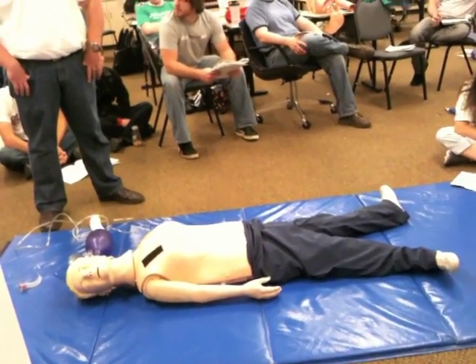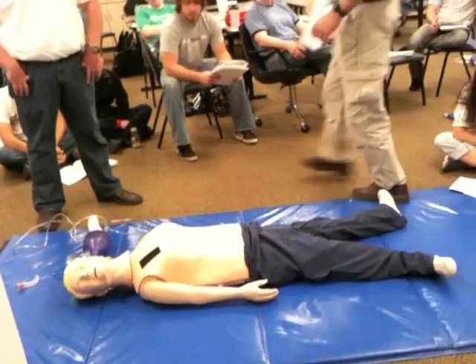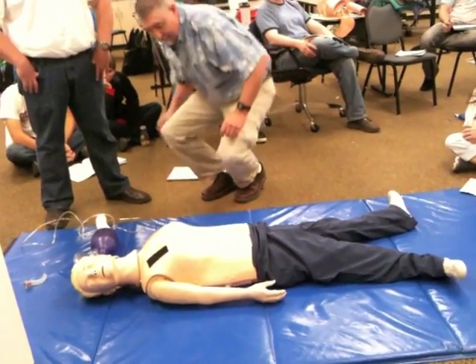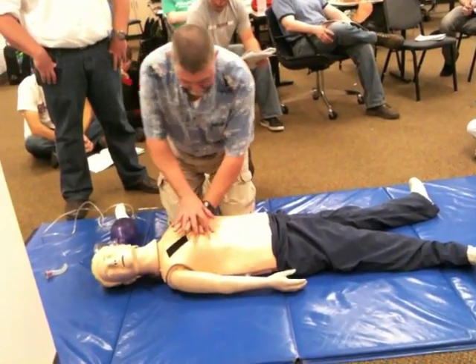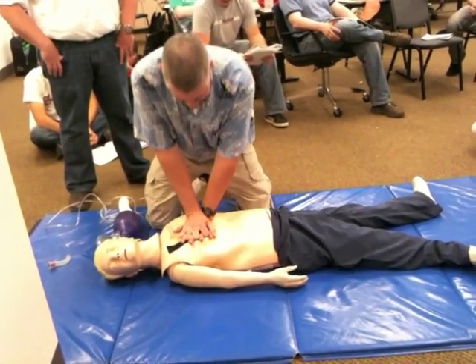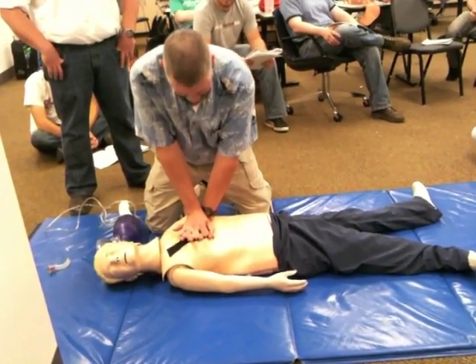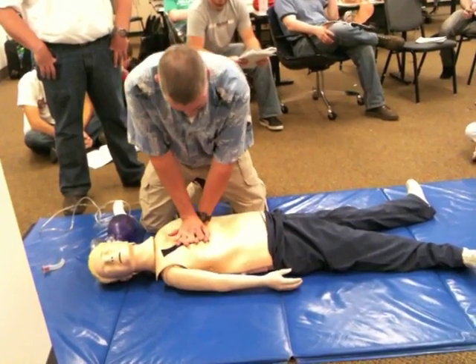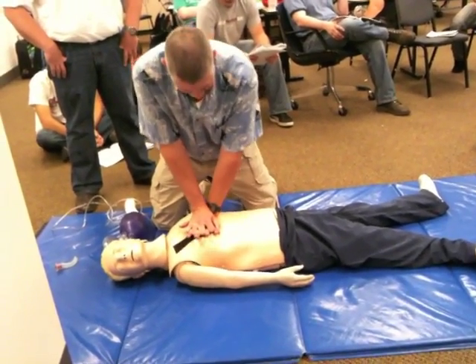I'll assume the role that Alan was doing, handling the critical criteria. I'm going to start with a scene size-up. First of all, the scene is safe — we're not in a puddle of water or anything like that.